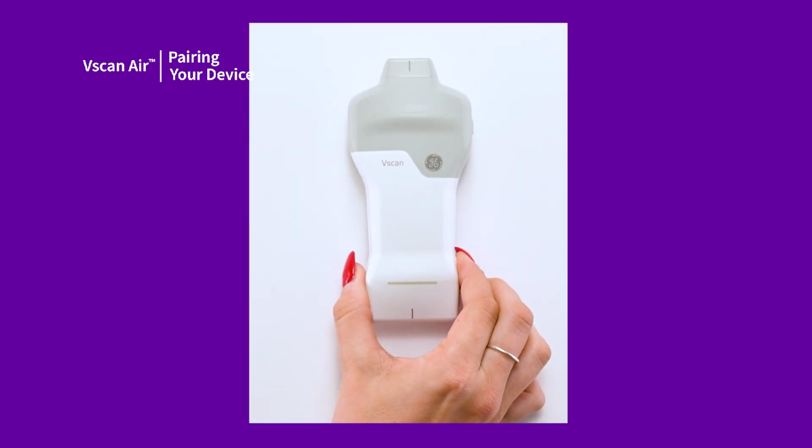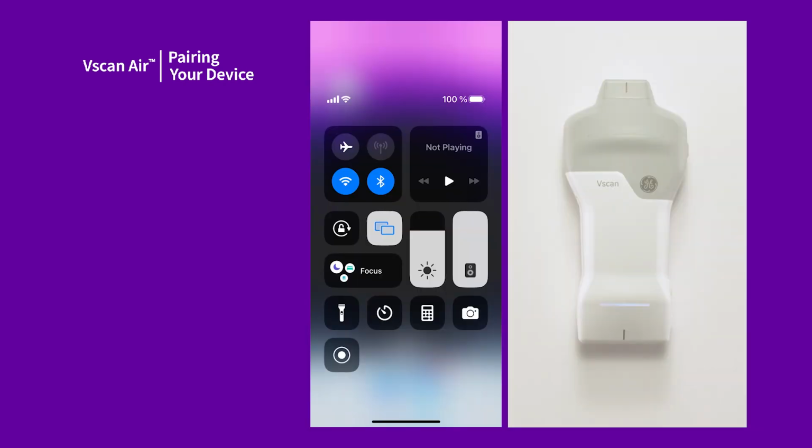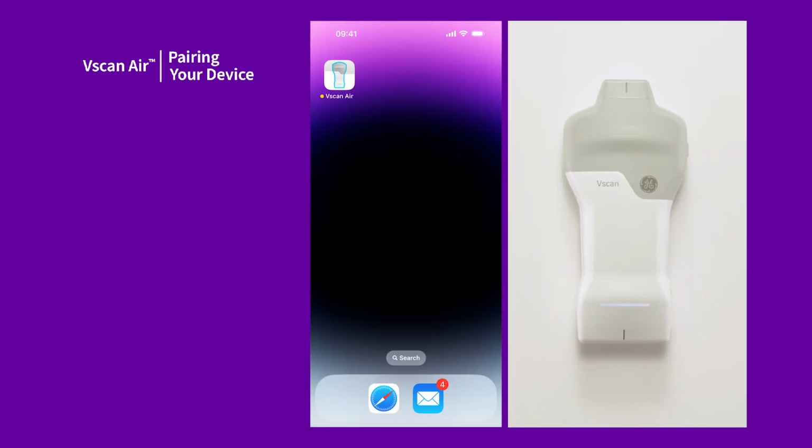Start by turning on your Vscan Air probe. A blinking white light alternating between the two ends indicates that the probe is booting up. Now open the Vscan Air app.